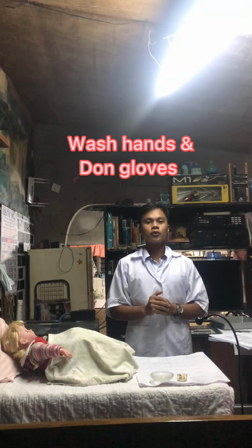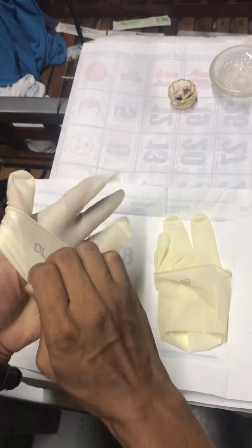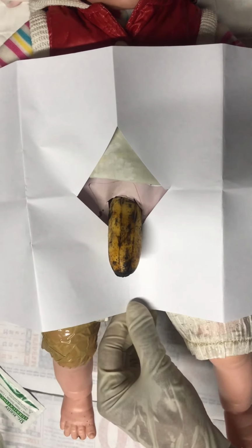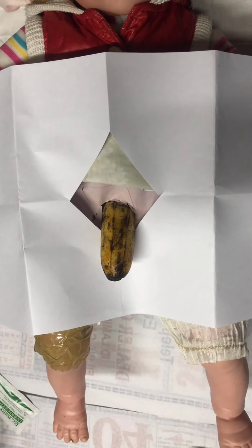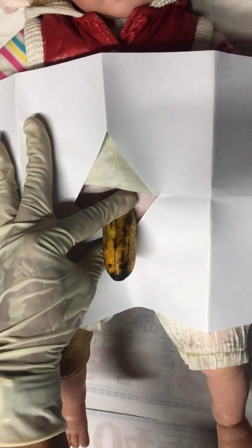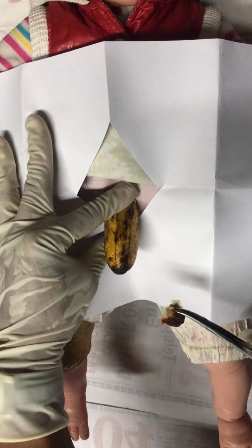Wash hands and put on the working gloves. The rationale of this is to prevent the spread of microorganisms. Don't forget to put the fenestrated or eye drape to prevent accidental contamination of other areas. Then hold the penis with the non-dominant hand. Disinfect the meatus twice using cotton balls with betadine solution.